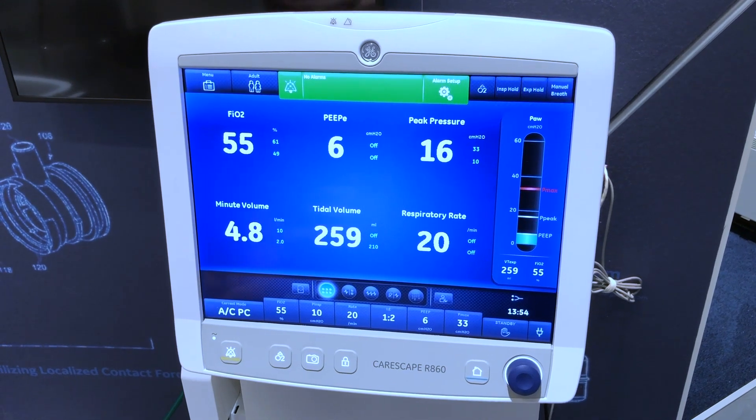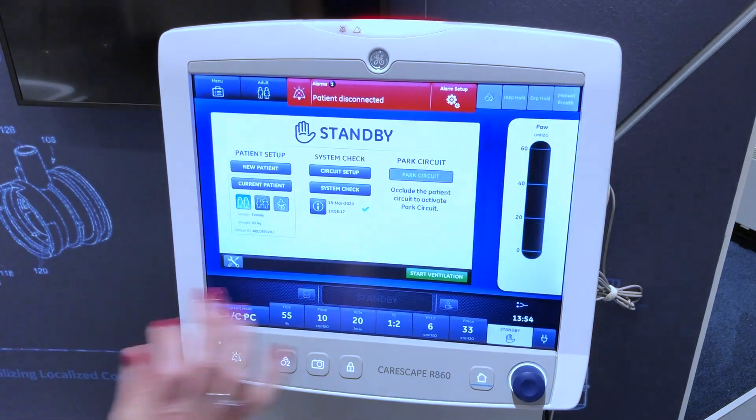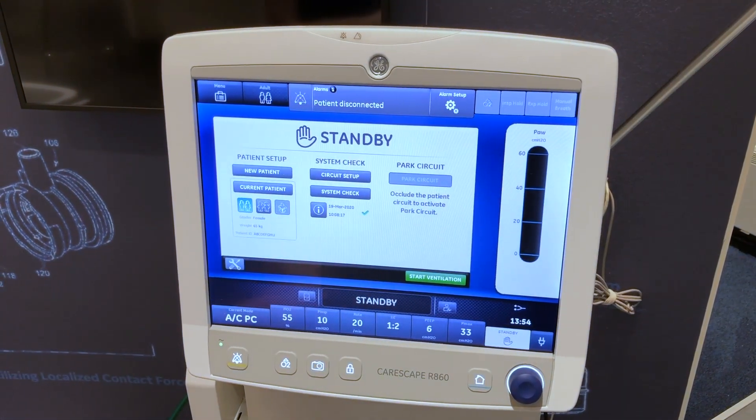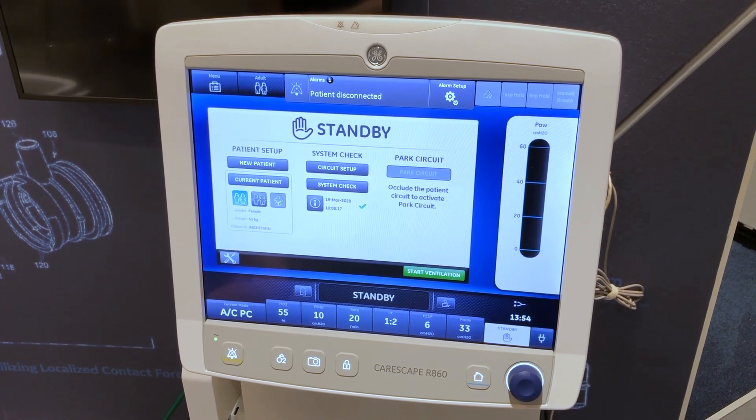Select standby, then select pause ventilation to go into standby. Ventilation and monitoring will be stopped.